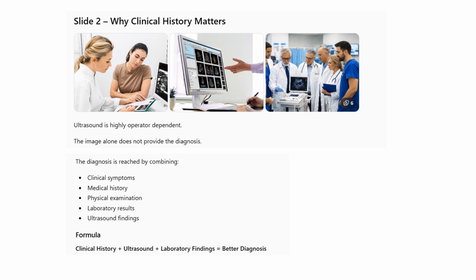So why does clinical history matter? Why should we bother ourselves with clinical history when doing ultrasound? Ultrasound is highly operator dependent. The image alone does not provide the diagnosis. The diagnosis is reached by combining the clinical symptoms, the medical history, the physical examination, laboratory results, and the ultrasound findings.